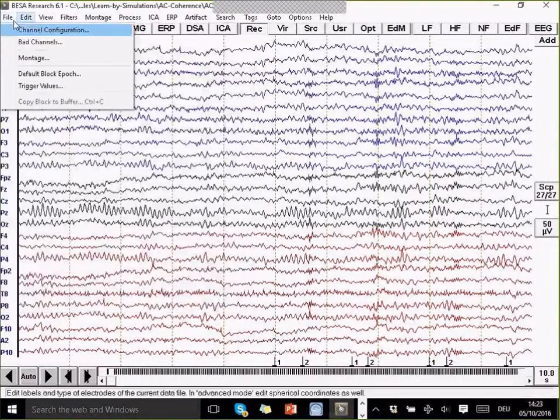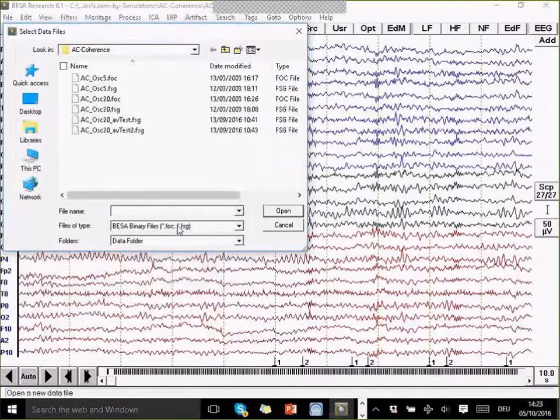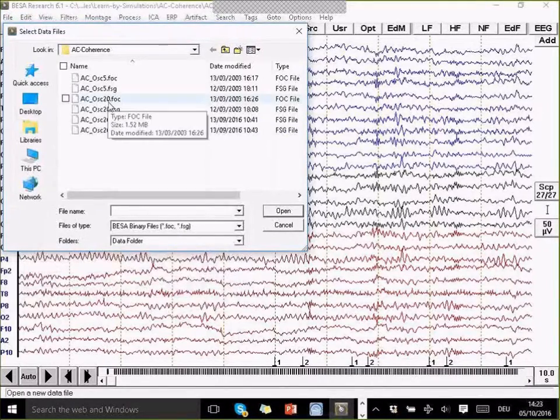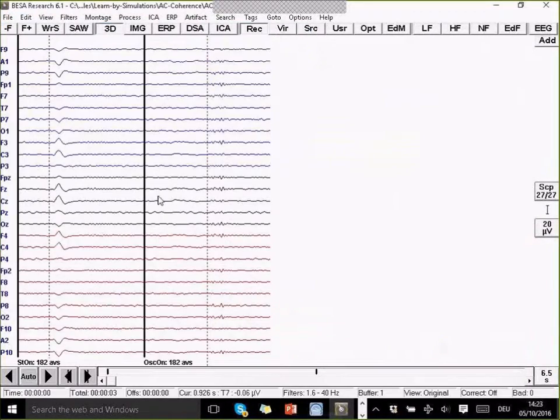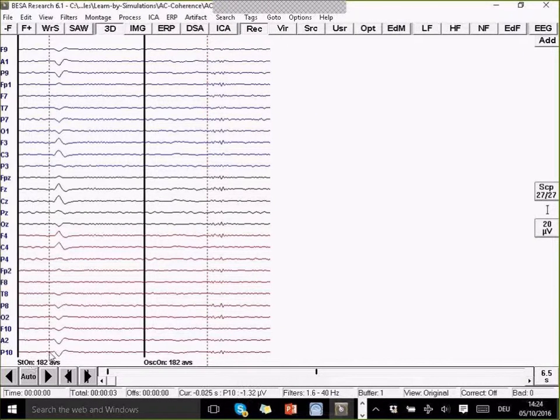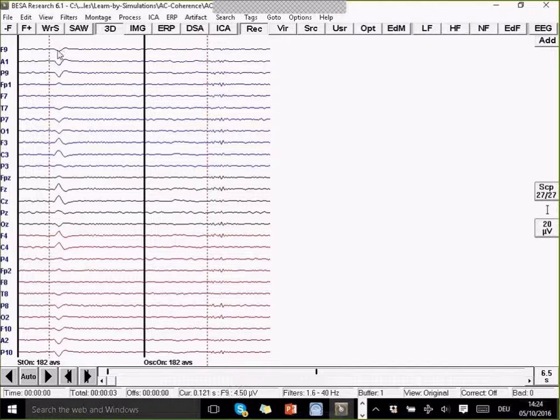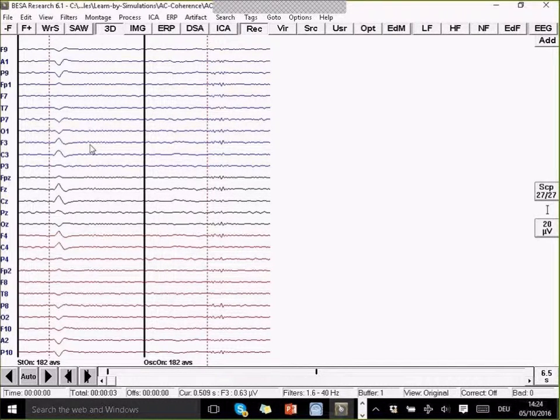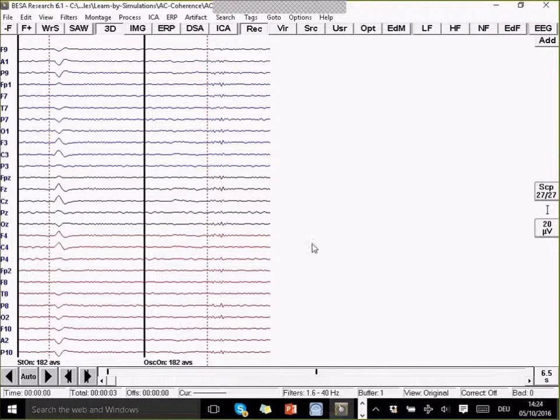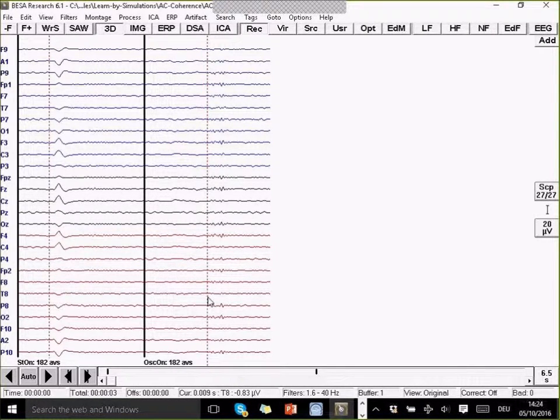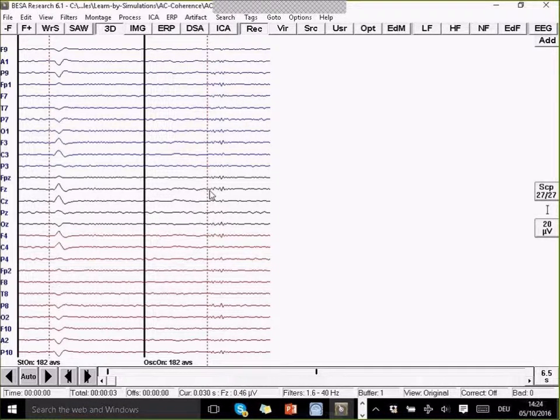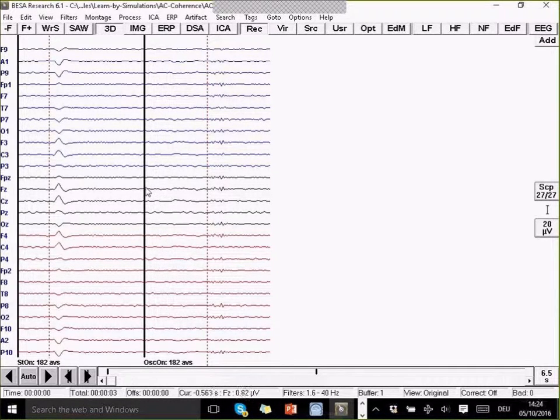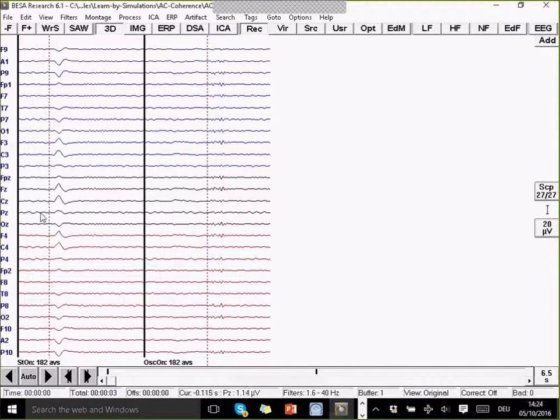If I average these up and show you the result of the average, then I can see if I average with trigger number one, I can get this response here. I can see very little of that oscillatory activity that starts later. If I average trigger number two, then I can see some of the oscillatory activity, but I can see hardly anything of the static stimulus before. So that's the way we created the simulation.